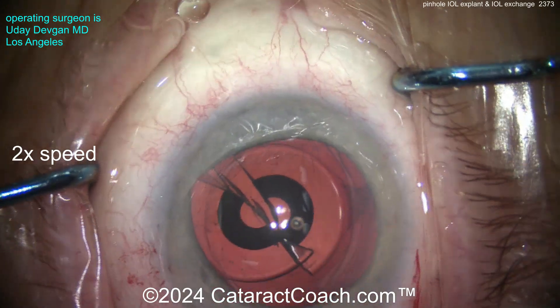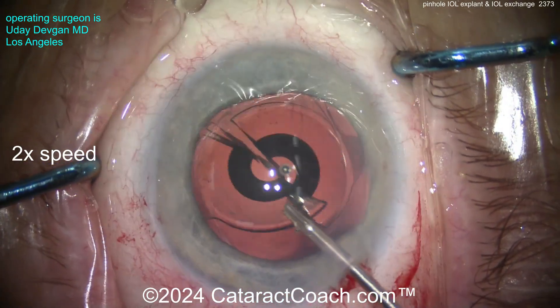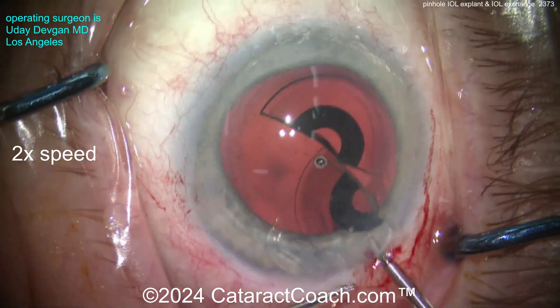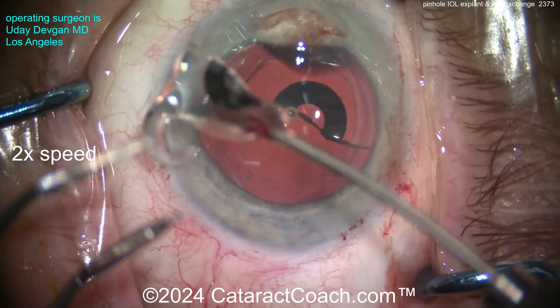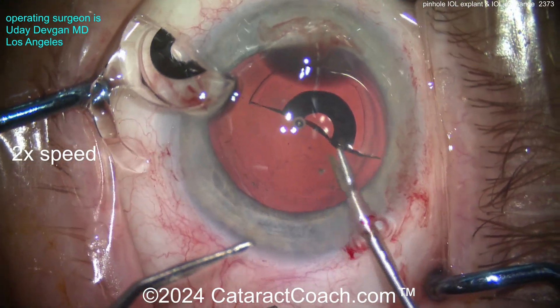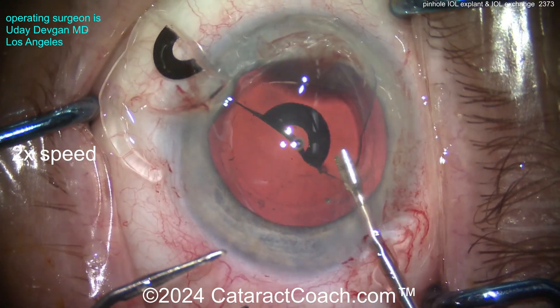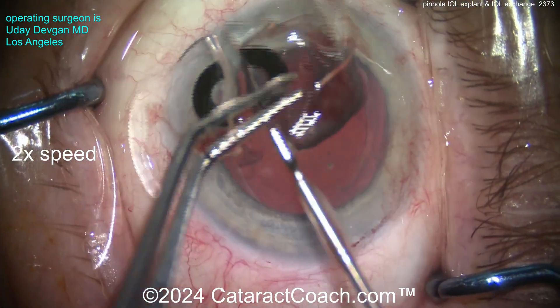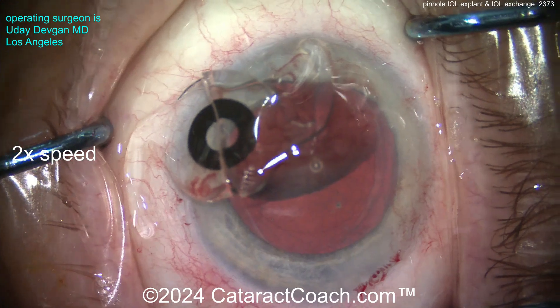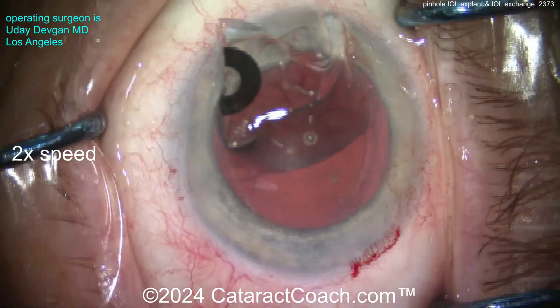There — we've got two halves. Each half can be pulled out of the eye through the incision nice and easy. Grab it and pull it right out. Take your time. When you pull the pieces out, I like to put them on top of the cornea and put them together — just to confirm yes, I removed the whole lens and there are no slivers remaining in the eye. Perfect.